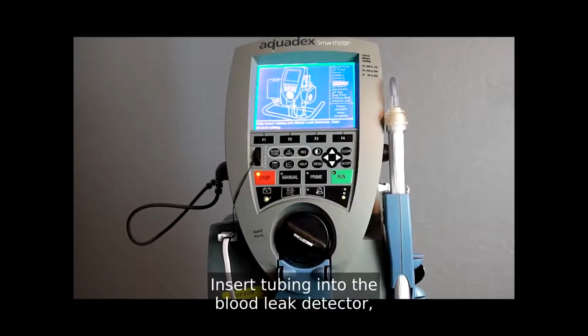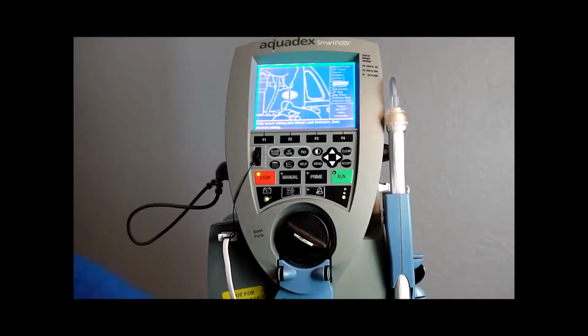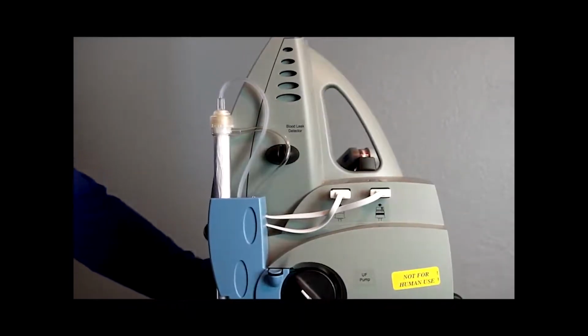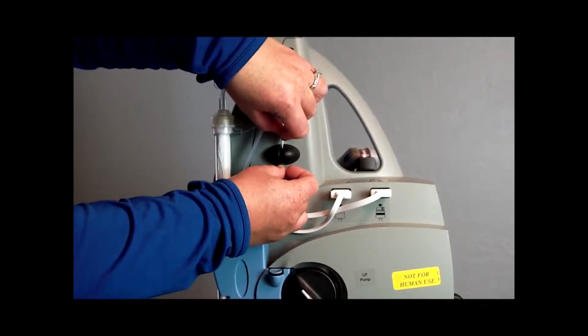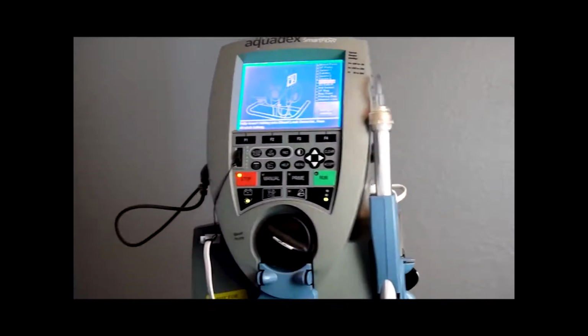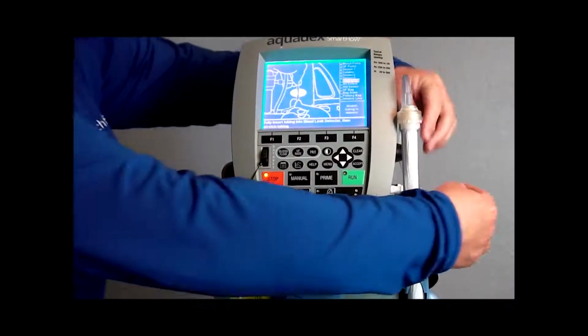Insert tubing into the blood leak detector, then stretch tubing. Stretch tubing in detector.